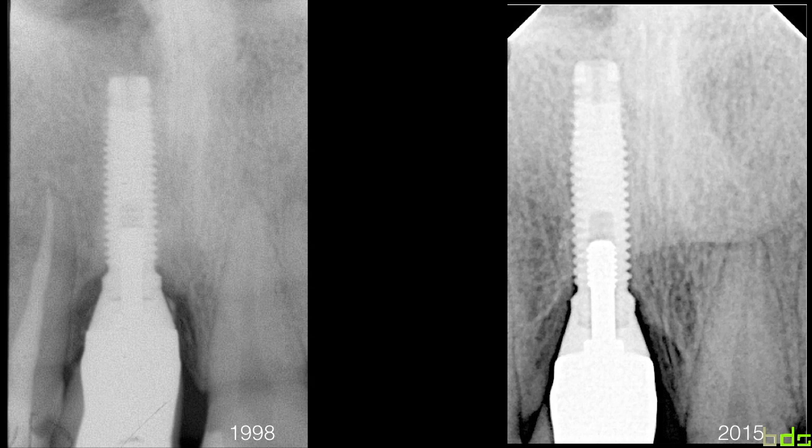So with our current knowledge of macrogeometries, as far as the connection is concerned, this is the connection that has the most microbial leakage, that is prone to more dieback of the bone and saucerization and cratering and losing bone. And yet again, this implant stands the test of time. It's been here for 17 years and stable.